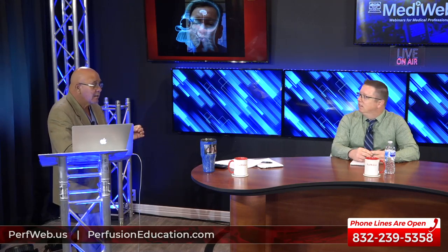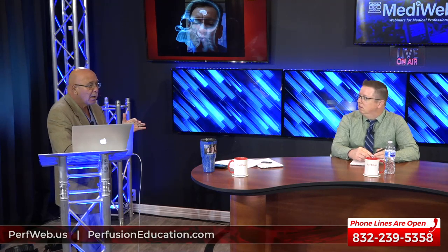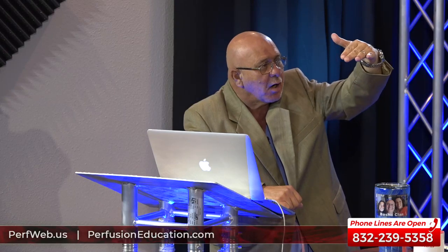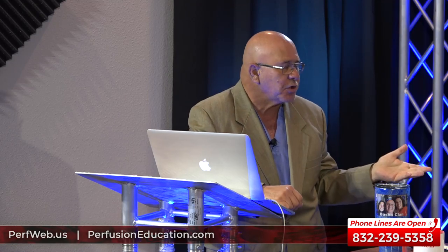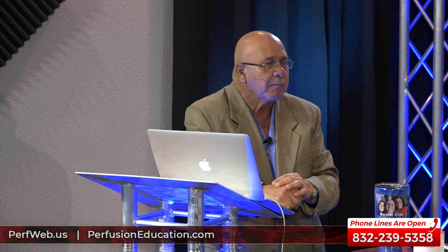I think that there's two different ones. I showed you the Sentinel, the Claret one, or the Sentinel Claret. And then there's another one that I can't remember the name of, but it basically covers all three of the arch vessels. But that is an embolic collection device. This one is a deflector. And it's essentially a net that goes around the aorta where the arch vessels are, all three. And then anything that hits it will go downstream to where hopefully it wouldn't do as much harm. Right, right. So that's how that works. Okay. So there's two out there.